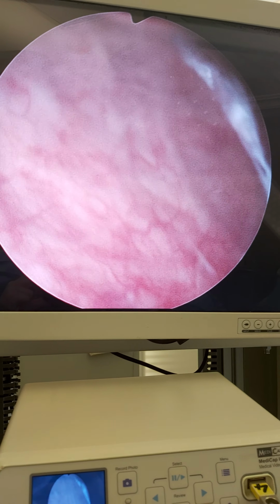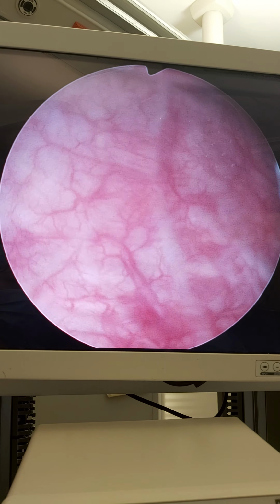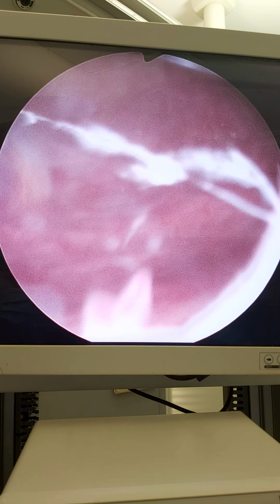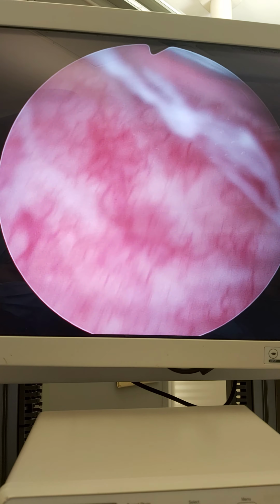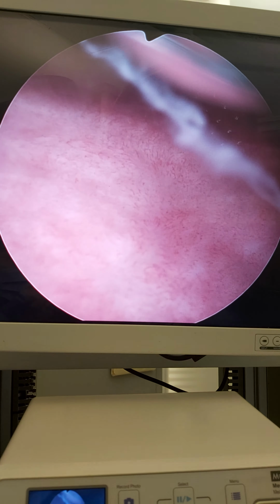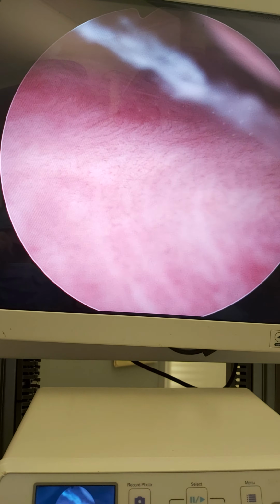Okay, now we are doing this lady a second fulgurate cystoscopy actually. Last year we did a cystoscopy on her, and when we enter inside, yeah, these are some infected particles floating. There are some red patchy areas in the opposite wall. Here, some areas. This is the newly formed mucosa that we fulgurated last year. It seems quite good actually.